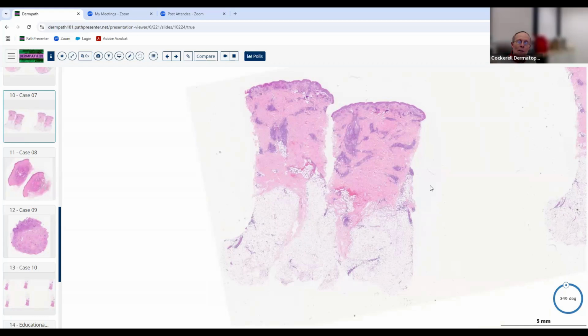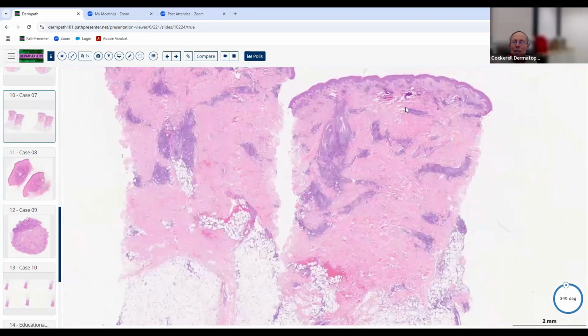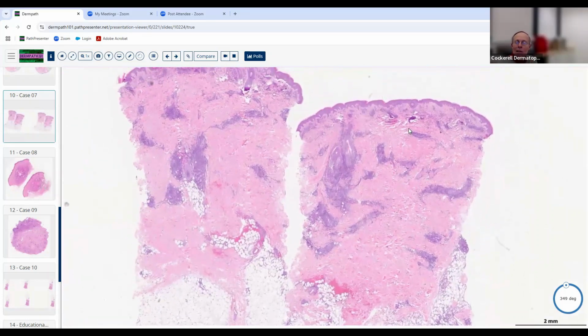We look at low magnification, this is a lymphocytic infiltrate. I'm not going to think about vasculitis here. I'm not going to think about panniculitis here. I'm not going to think about scleroderma and all these various things. I'm going to think about the lymphocytic infiltrates. So that's why we do it. You're not going to be wasting a lot of time when you've already honed it down at low magnification. You're going to think about the 5 to 7, 8 L's, if you will, that give you a lymphocytic infiltrate, and see if you can apply secondary layer criteria to help you make the diagnosis.